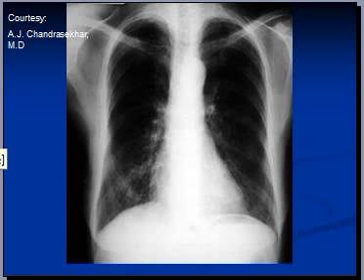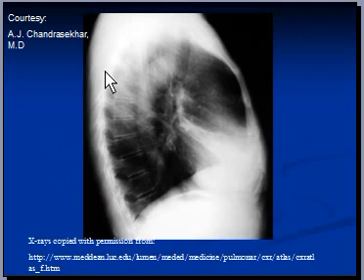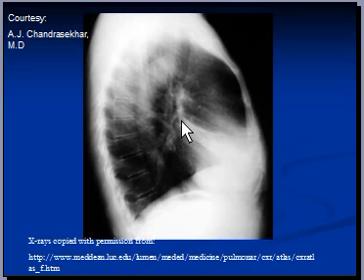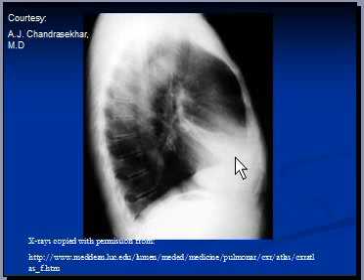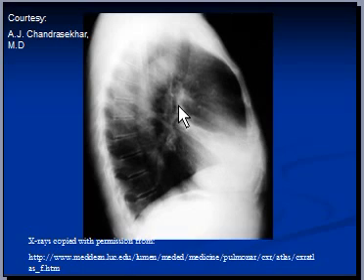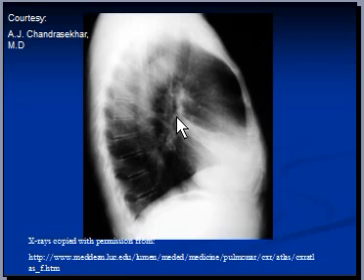To really convince yourself, you'll have to see the lateral view. Again, a barrel-shaped thoracic cavity — the AP diameter or anterior-posterior diameter is increased, again indicating COPD. But what is more obvious is this anterior triangular opacity. Notice the right hemidiaphragm is raised anteriorly only. This is the left hemidiaphragm, which continues with the heart border. The opacity is clearly outlining the horizontal fissure and the oblique fissure. The horizontal fissure should normally be somewhere here, and the oblique fissure runs from T4 down — so both fissures are displaced.